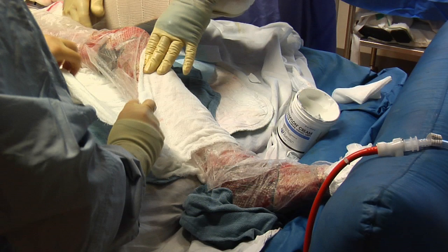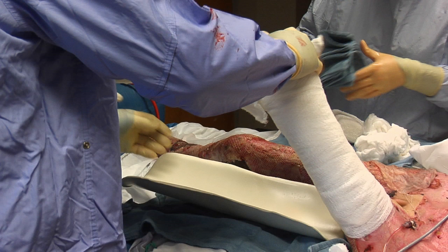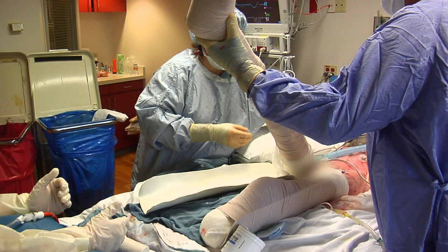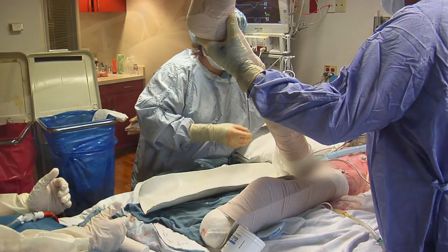Patients with burns involving the knee area will frequently maintain the knee in a flexed position of comfort. Extension should be maintained with a posterior splint or knee immobilizer until the patient exhibits sufficient strength to fully extend the knee.